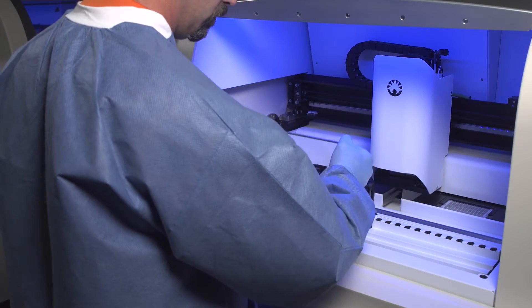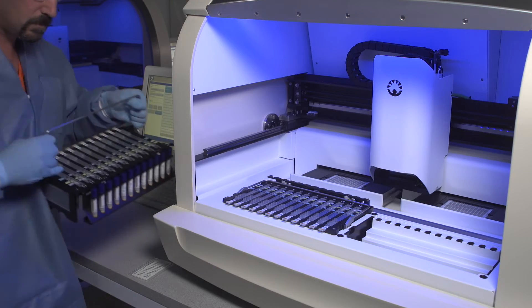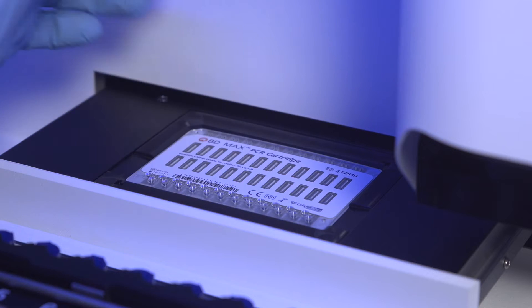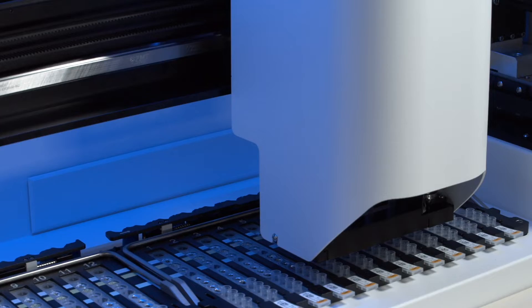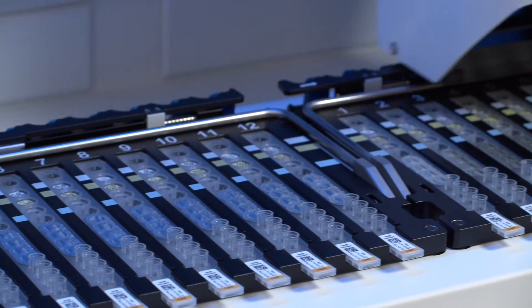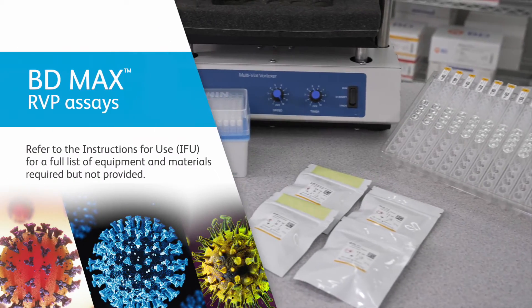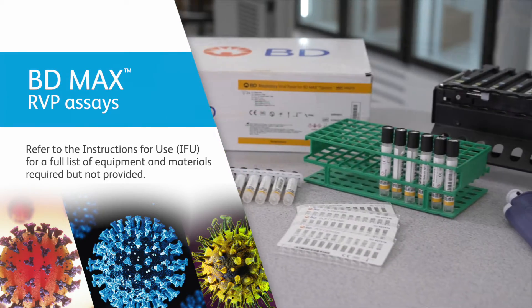The BDMAX system is loaded with the BDMAX racks containing the prepared sample buffer tubes and assembled unitized reagent strips and the PCR cartridge. The BDMAX system automates sample extraction, nucleic acid amplification, and detection of the target nucleic acid using real-time polymerase chain reaction. For a full list of equipment and materials required but not provided, please refer to the instructions for use.